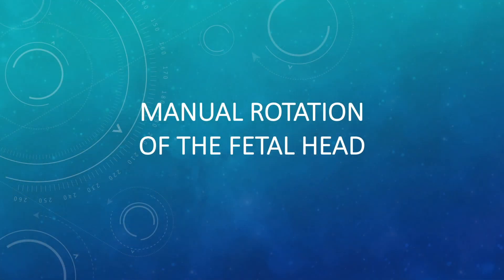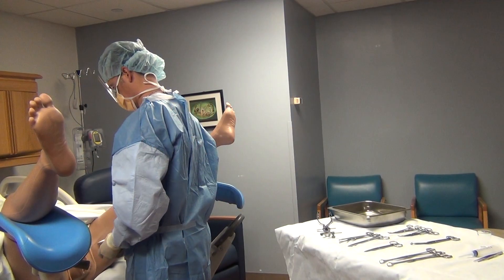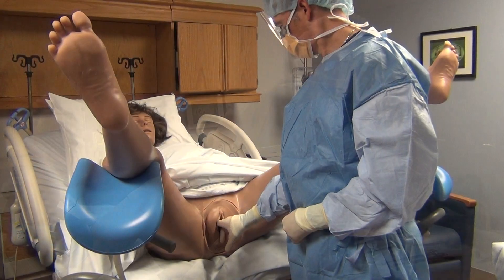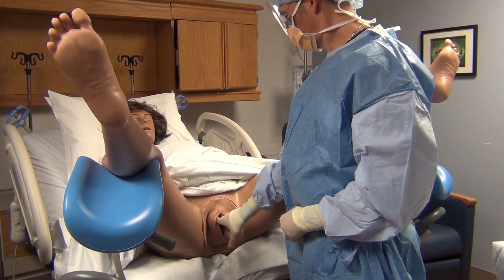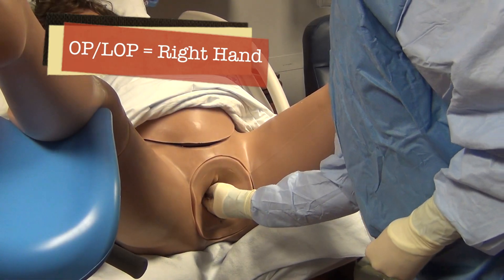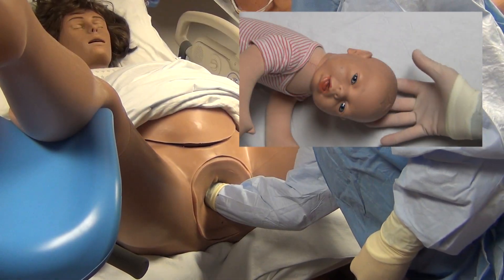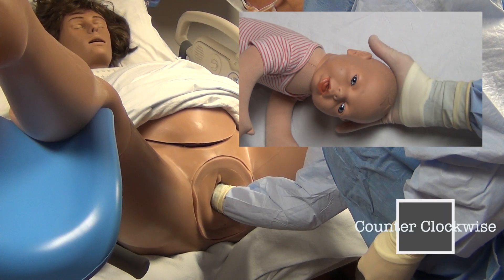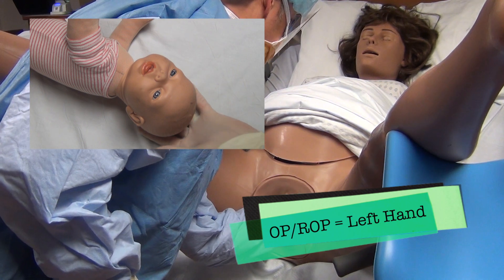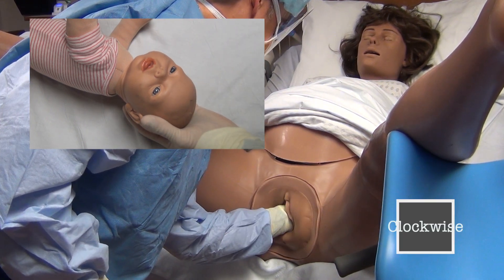We will next review the technique for manual rotation of the fetal head. After confirming that the patient has adequate anesthesia and a drained bladder, the examiner's hand is introduced into the pelvis. Prior to this, we confirmed fetal head position digitally and with ultrasound, so that for a fetus with an OP to LOP position, rotation is performed with the examiner's right hand in a counterclockwise rotation, and for a fetus with an OP to ROP position, rotation is performed with the examiner's left hand in a clockwise rotation.